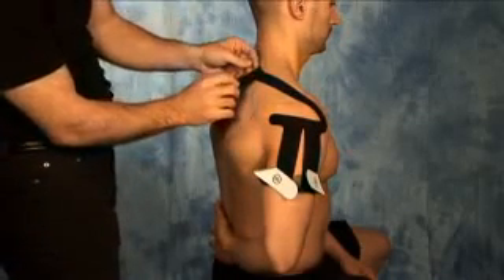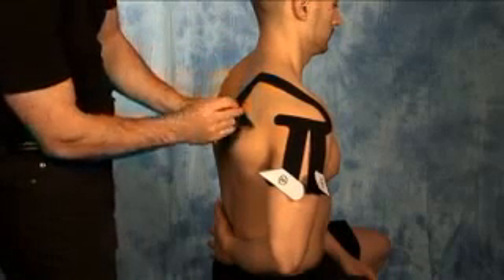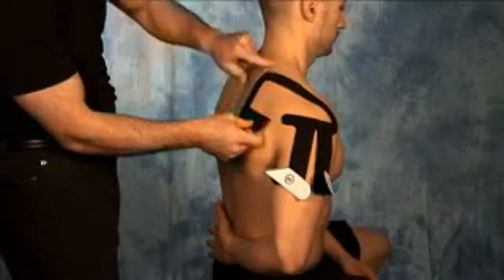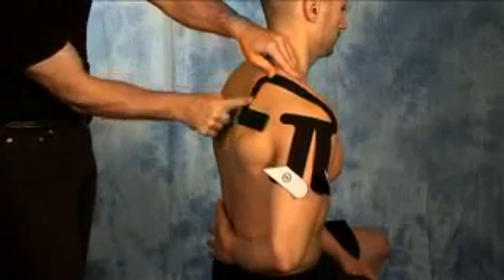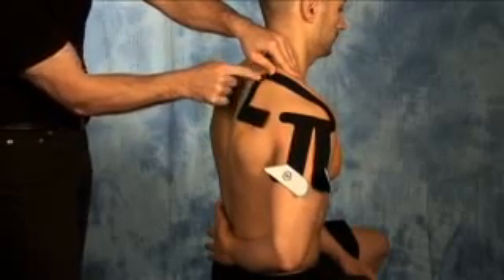For section number three, just peel back the entire portion and let the tape come in gentle contact with the skin along the back part of the shoulder, with no stretch on the tape. Once applied, smooth out any creases and activate the glue.